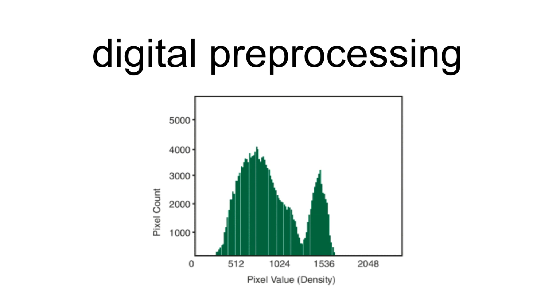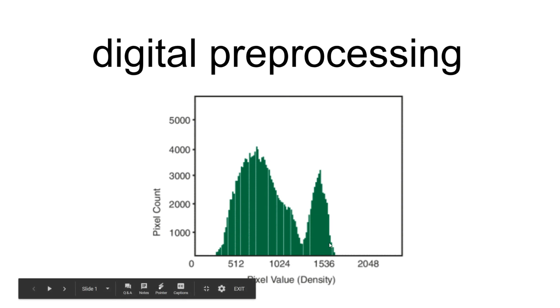Very quickly, it is a graph that indicates all of the pixels that you have on your image and what brightness levels there are for those pixels. So each one of these bars, right, indicates a certain grayscale, right?